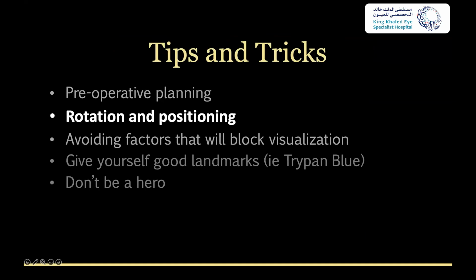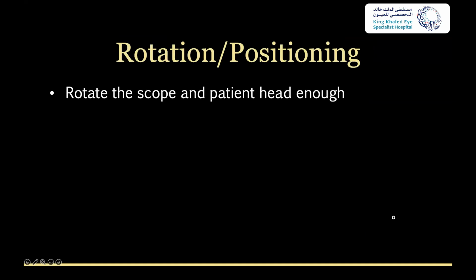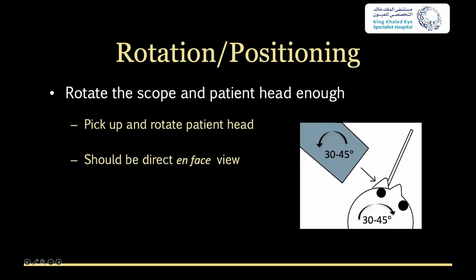The other thing is rotation and positioning. So this is right at the start of your surgery and can really make all the difference in the world to make your surgery, whether it be really hard or very easy. And I find that you really need to make sure that the scope and the patient head are rotated enough. You're trying to get a direct en face view of the angle.